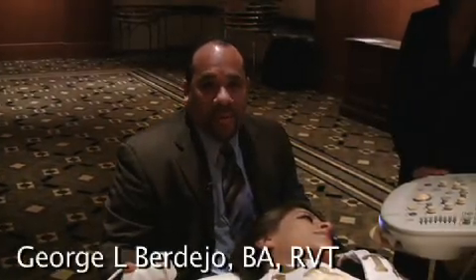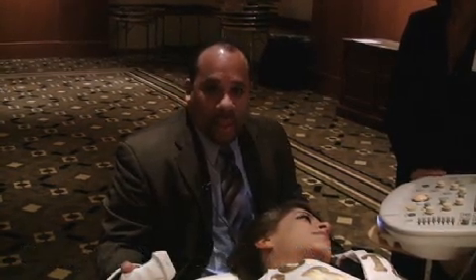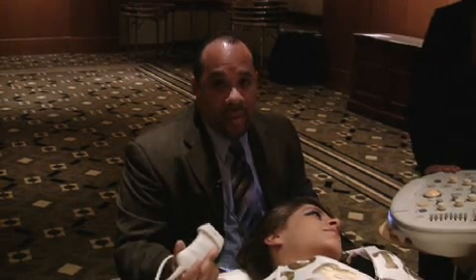Hi, my name is George Berdejo, and I am the Director of Vascular Ultrasound Services at Montefiore Medical Center in New York City. I'm a registered vascular technologist. I'm also a fellow for the Society of Vascular Ultrasound, and today I'm going to be going over carotid artery ultrasound techniques and some pitfalls and pearls and other techniques to help guide you through the performance of carotid artery ultrasound.